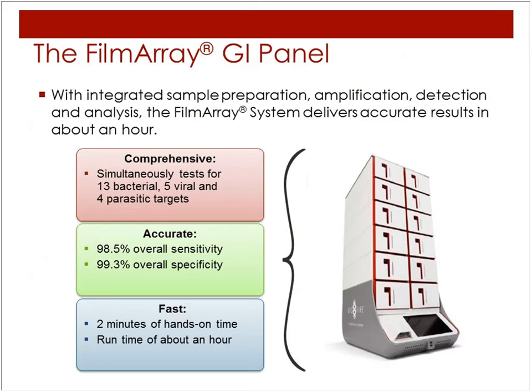The GI panel from BioFire is tested on the FilmArray system, which is an integrated system that allows for sample preparation, amplification, detection, and analysis all within 1 hour. And the image here is of the new Torch system that was FDA cleared for clinical use. And basically, it allows for multiple testing of samples at a time instead of the one at a time that you're usually used to with the old system.